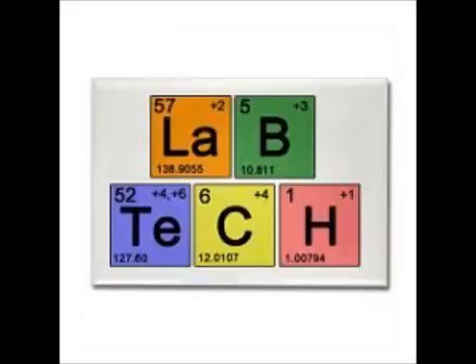I think you guys are going to get this because you seemed pretty good when we did factor 8 and 9, what was corrected. So I think you guys are going to be good. So what does normal plasma have in it? And that has to be the first step of any mixing or stuff. I call them substitution studies. A lot of places call them mixing studies. They're one and the same.